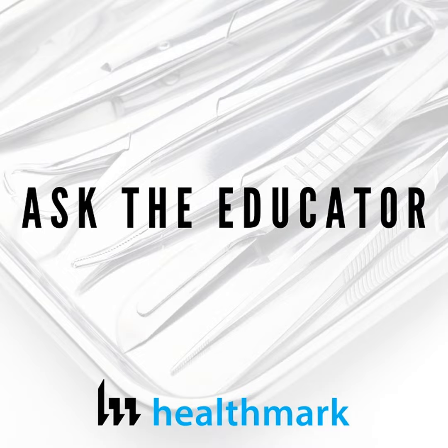Yeah, Spaulding is the pinnacle. It's the cornerstone of infection prevention. It's been almost 50 years since it was first conceived and written. Spaulding looked at biological pathogenic infections and wanted to come up with a way of addressing infection prevention and disinfection of reusable devices, or just devices in general, used in a healthcare setting. Taking the culmination of cell biology, immunology, medical practice, and pathology, he distilled it down to a very simple three-step paradigm that correlates to exposure or risk of exposure.